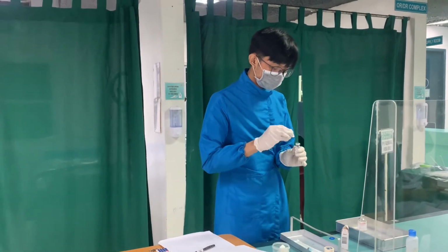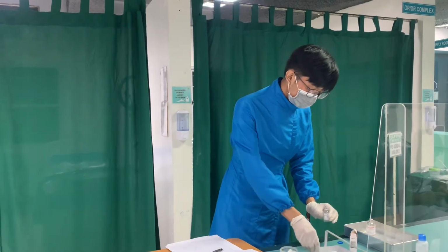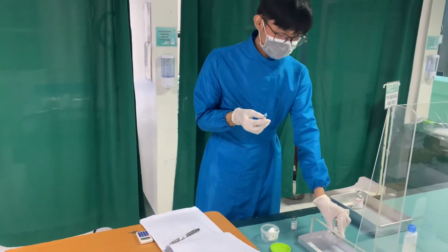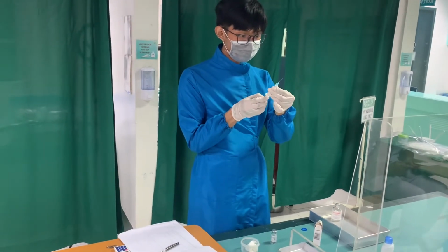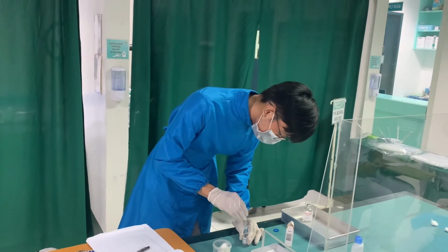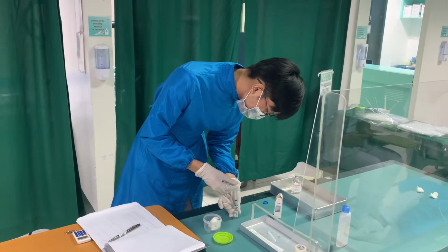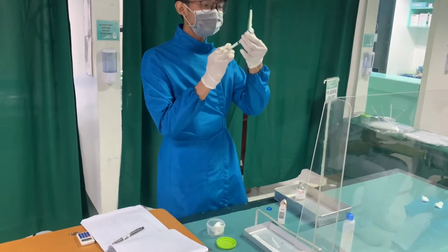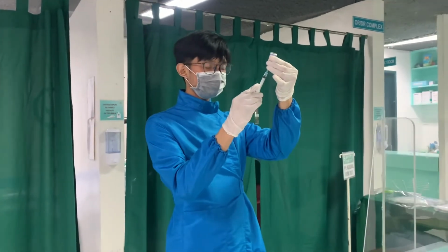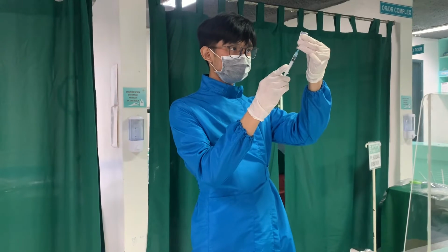Then swab the rubber top with the antimicrobial swab and allow to dry. Remove the cap from the needle or blunt cannula by pulling it straight off. Touch the plunger at the knob only. Draw back an amount of air into the syringe equal to the specific dose of medication to be withdrawn. Some facilities require use of a filter needle when withdrawing premixed medications from multi-dose vials.